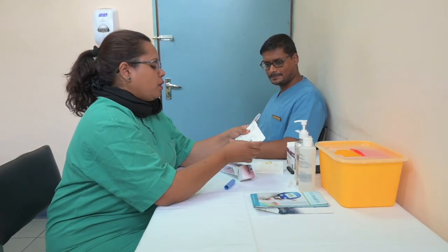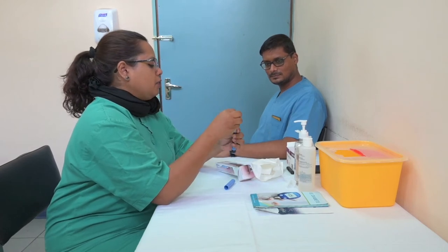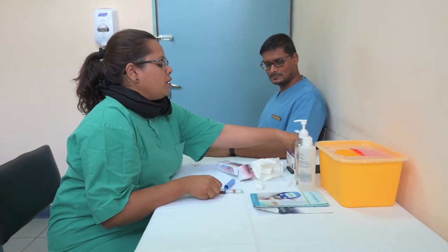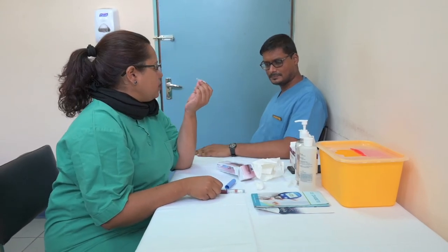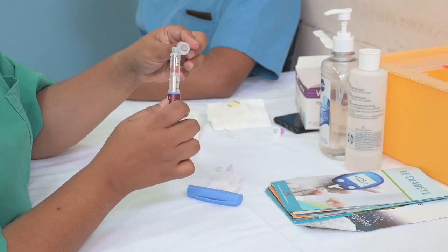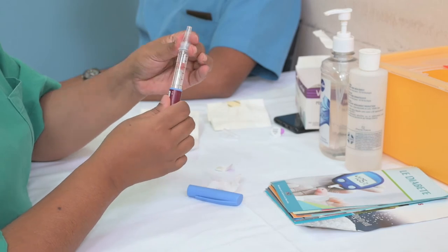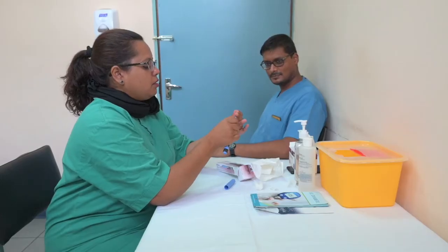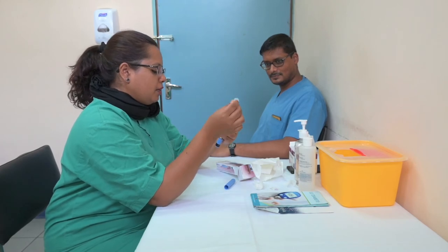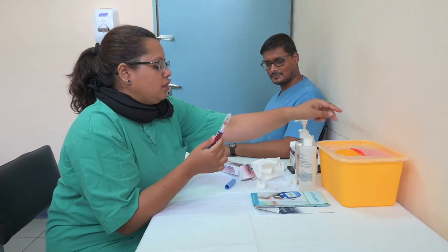Take an alcohol swab. You swab it here, you clean it, okay? Then you take a needle. Each time you use the insulin pen, it should be clean and a new needle should be used, okay? Then you just rotate it clockwise, like this. It's ready. You remove the big cap here again. Then remove the small cap and discard it.